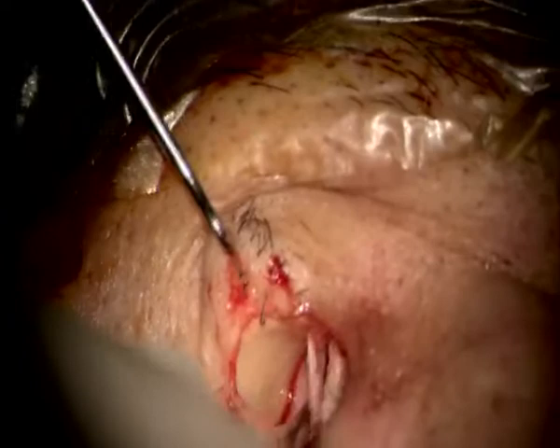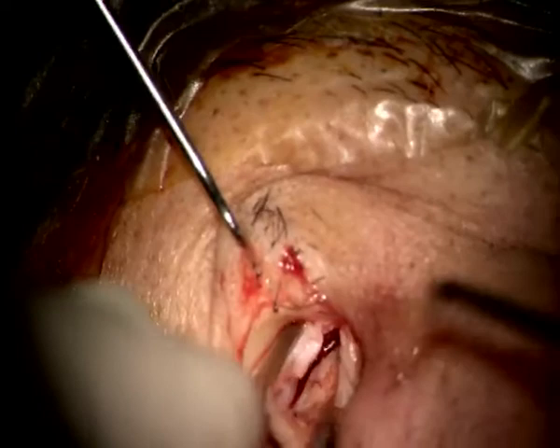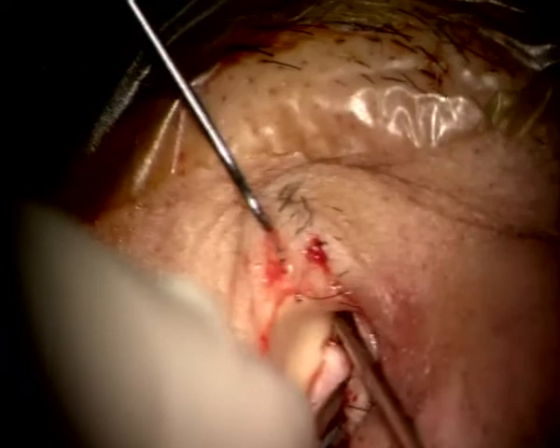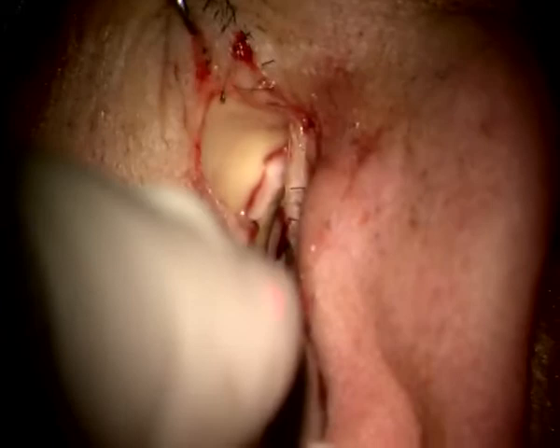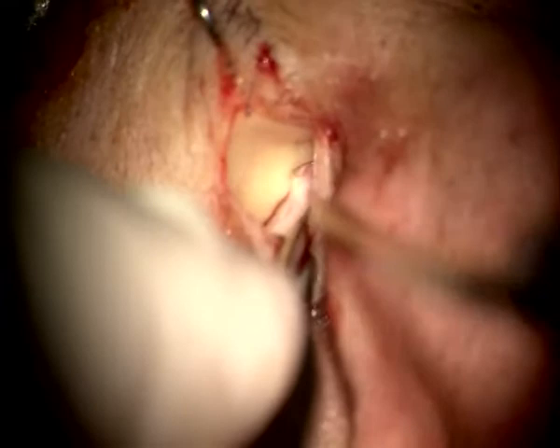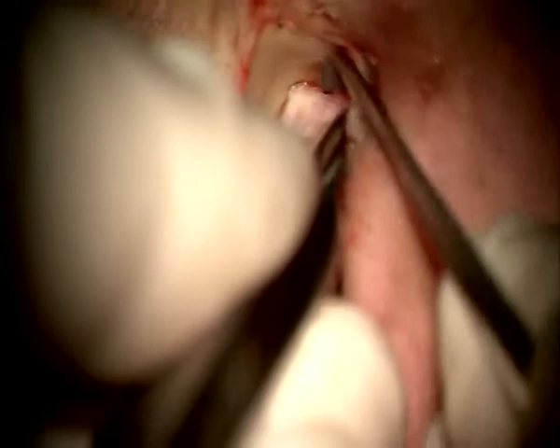So you could see the bottoming, the blood vessels, they basically creating a button, so limiting the depth. You can see it right here. You see it, Mustafa? Yeah. But that's why you have to go laterally rather than depth. So this blood vessel here creates a button-like, so it limits how far you could go. But here you could see that superiorly, you could go quite a bit.